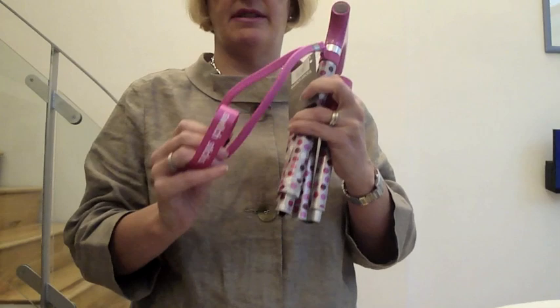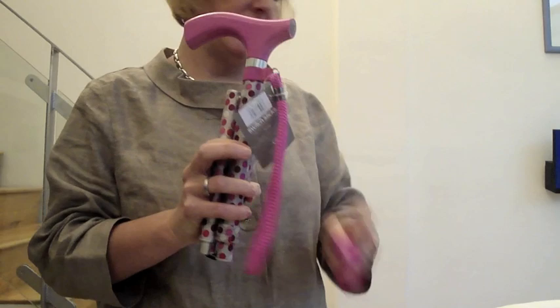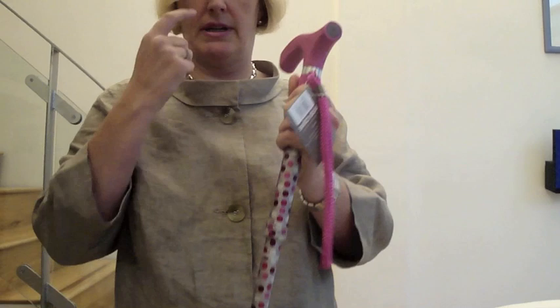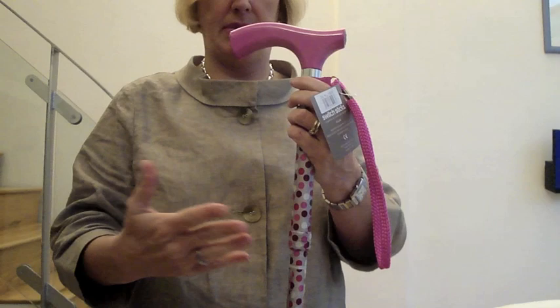Once you've taken the Velcro band off, to open the stick you take the top section and the bottom section. You must hold those two so that when it flicks out you've got it completely in control and you're not going to injure anybody. It's not going to injure anybody, so don't worry, just make sure you're opening it very carefully.